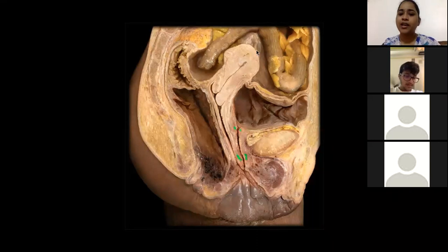Okay, now see here, the uterus. Can you see the uterus is lying over the urinary bladder? The vaginal cavity is going backwards and upwards, whereas the uterus is forwards and downwards. So here there is an angle, first line here and second line here. So there is an angle formed between the vaginal cavity and the uterus. This is called an anteverted uterus. The uterus is bending like this.